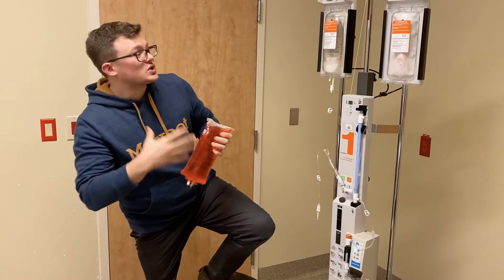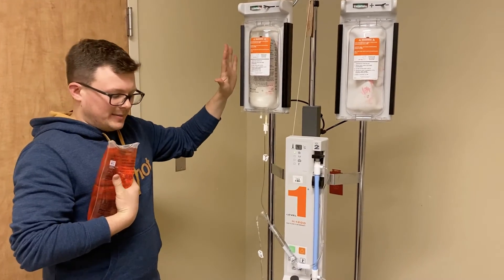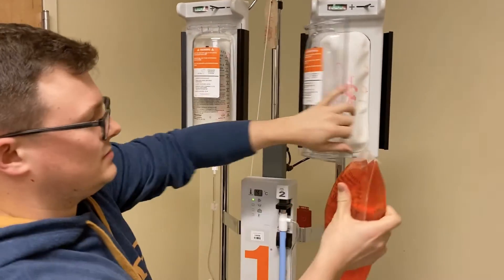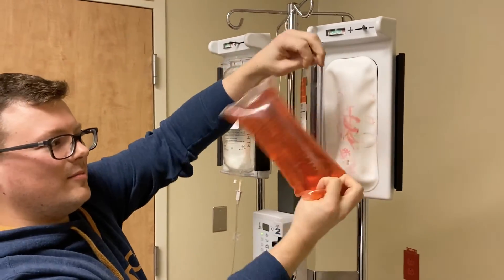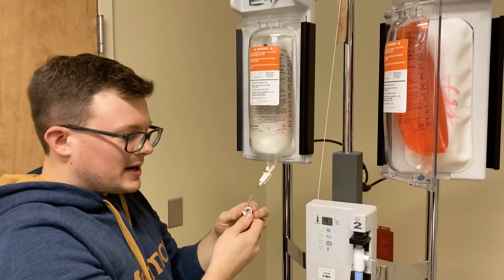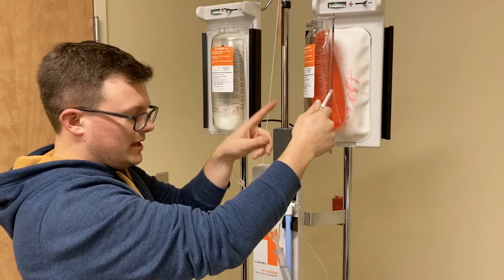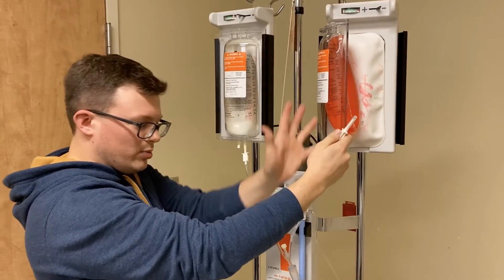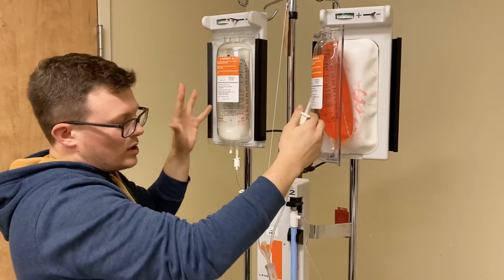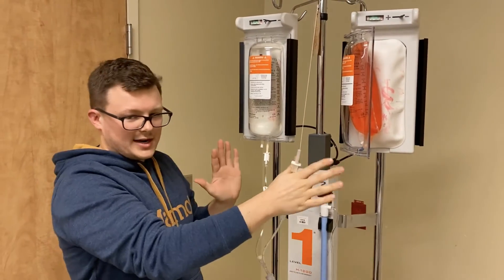Now let's talk about switching between bags. Ideally you only want one bag under pressure at a time — if you try to do two, you're not going to keep up. If you're switching and don't want to finish your saline, you always need to remember to clamp. If you do not clamp and you spike your next bag, one fluid will start going up into the other and it won't be going where it's supposed to go. If both are under pressure and unclamped it'll work, but stick to one bag at a time.